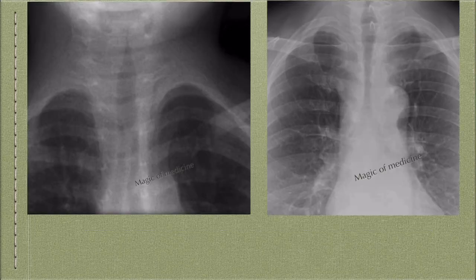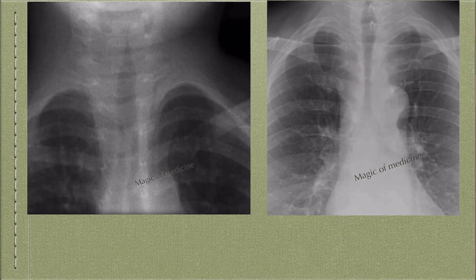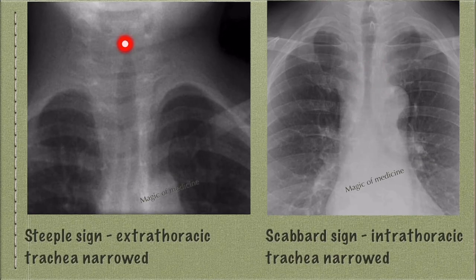Now a spotter for you: look at these two images — they are poles apart. In the first image, the extrathoracic part of the trachea is narrowed, while in the second image the intrathoracic part is narrowed. One entity involves the extrathoracic trachea and another involves the intrathoracic trachea. The answer: the first is the steeple sign, where the extrathoracic trachea is narrowed, and the second is the scabbard sign or saber-sheath trachea, where the intrathoracic trachea is narrowed.